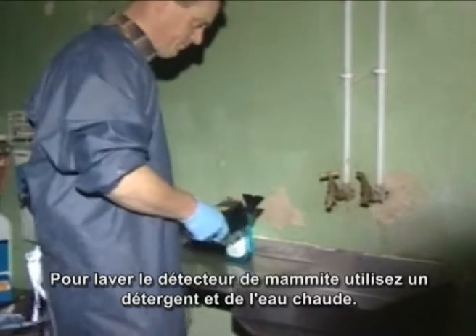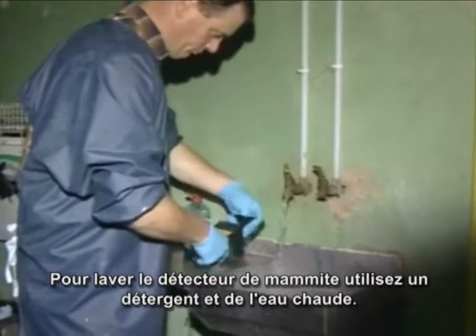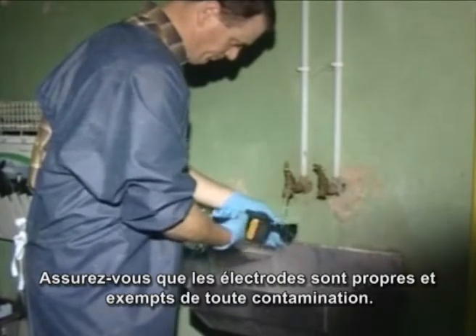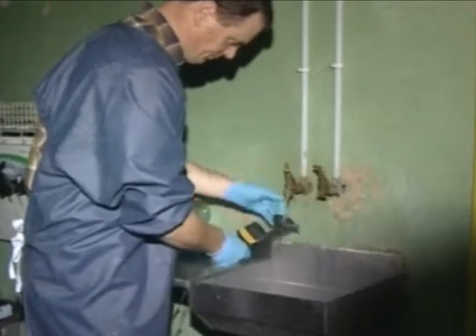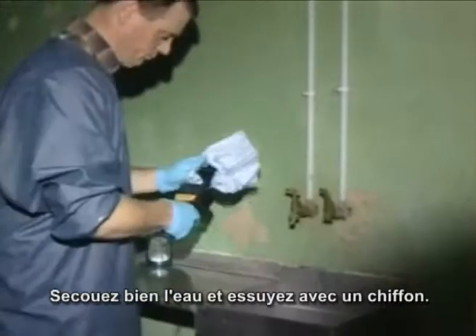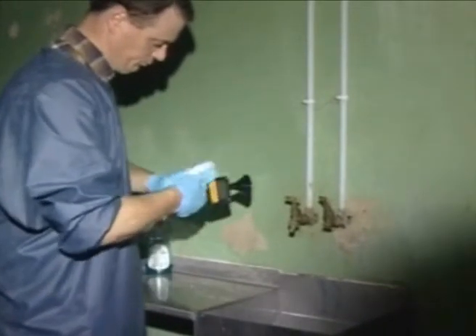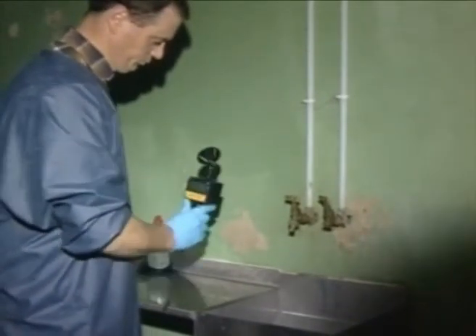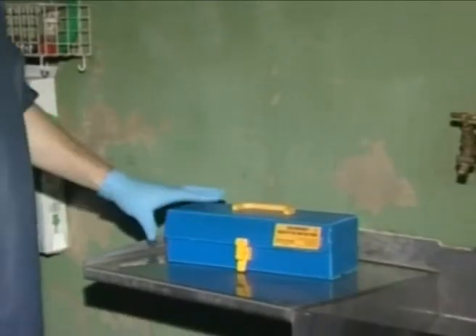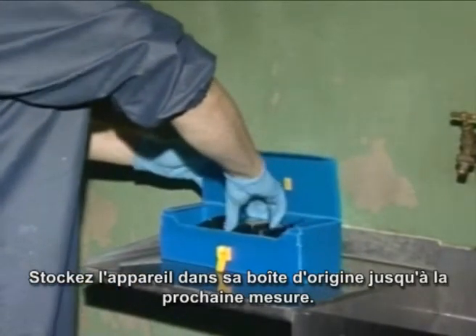To wash and clean your Draminsky mastitis detector, use washing-up liquid and warm water. Be sure to clean the electrodes well, free from all contamination. Shake well and dry with some blue roll, then store in its original container until next required.